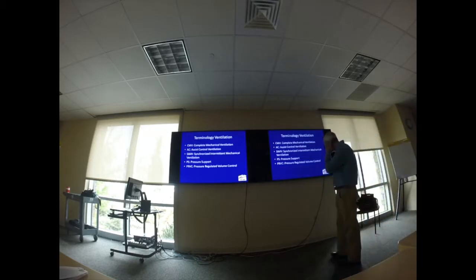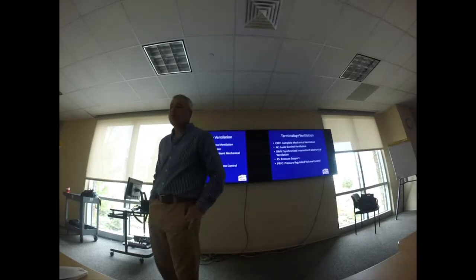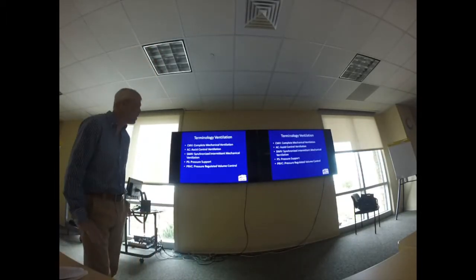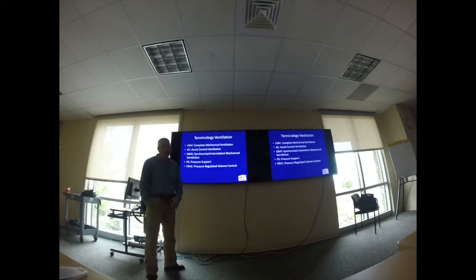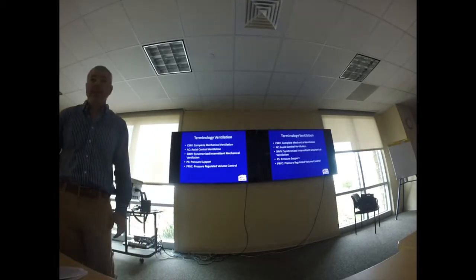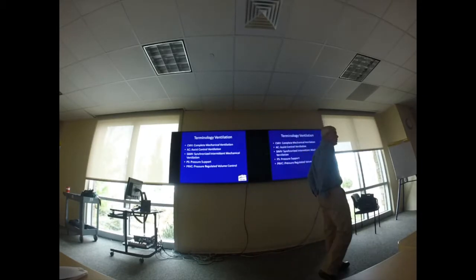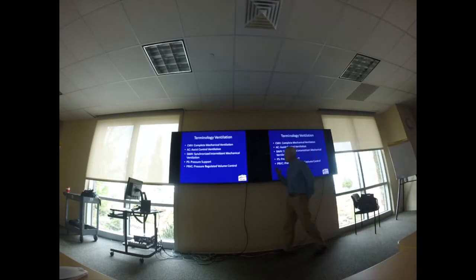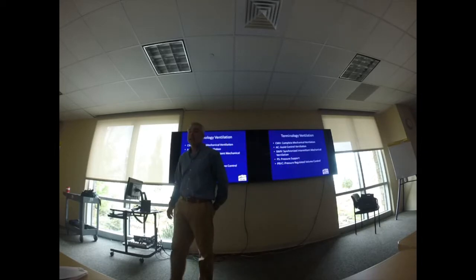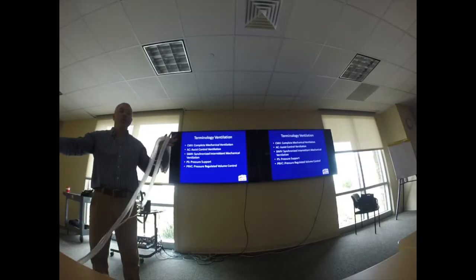Pressure support is not a mode of ventilation. It's more a mode of weaning or a mode of support. And what pressure support does for us in the transport setting is it allows the patient to take a breath without fighting all of the dead space. So if I have somebody on synchronized intermittent mechanical ventilation, and again I have them set at 12 breaths per minute, and they're taking 13 or 14 breaths, and they only want to take 250 or 300, I want to allow them to at least take the 250 or 300 and not have to fight the whole circuit, right?